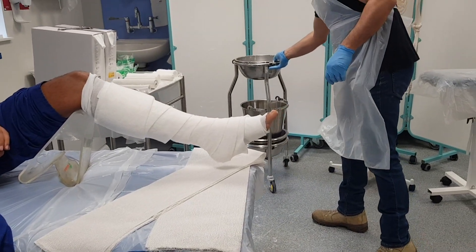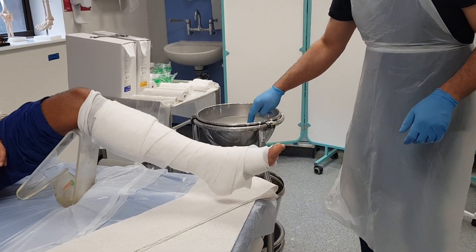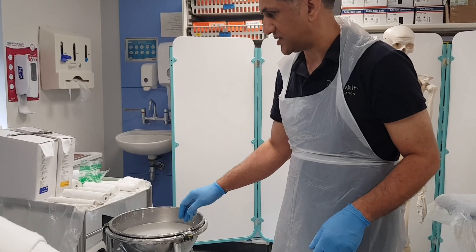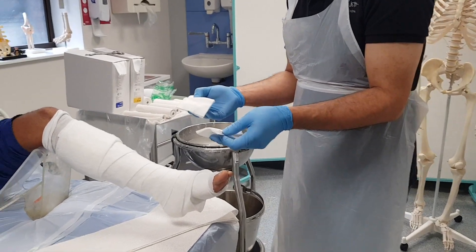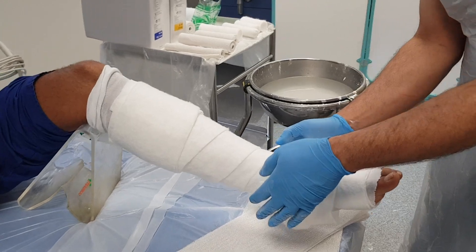Now I've got some water — it's just above room temperature but not too hot, because this is an exothermic reaction and I don't want it to burn. I might want to protect the malleoli by putting some extra felt padding around there to give a bit of extra padding.